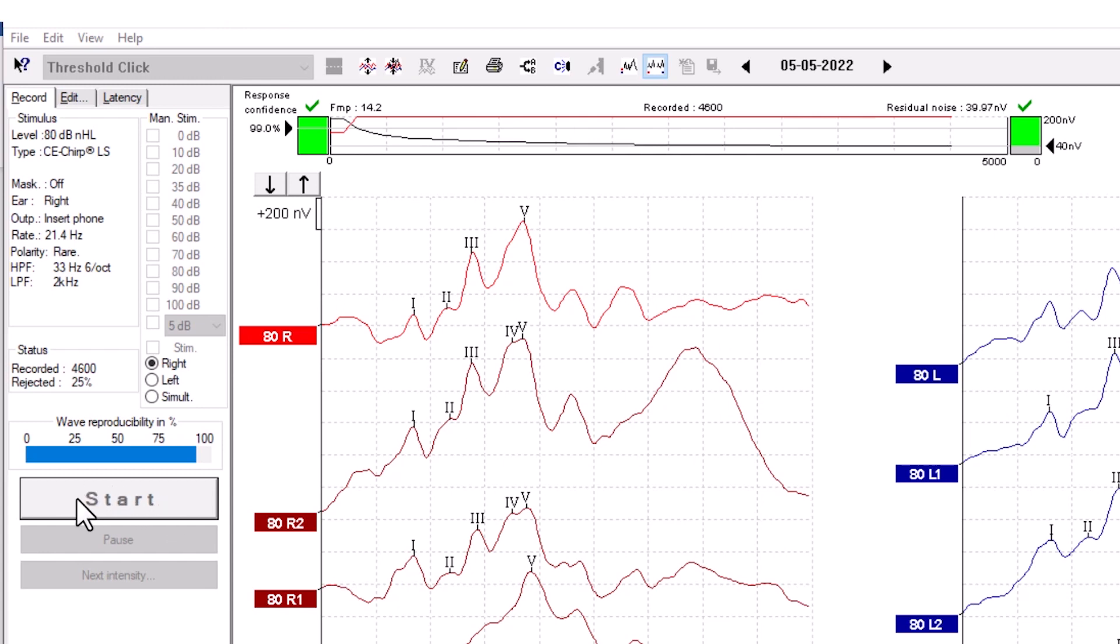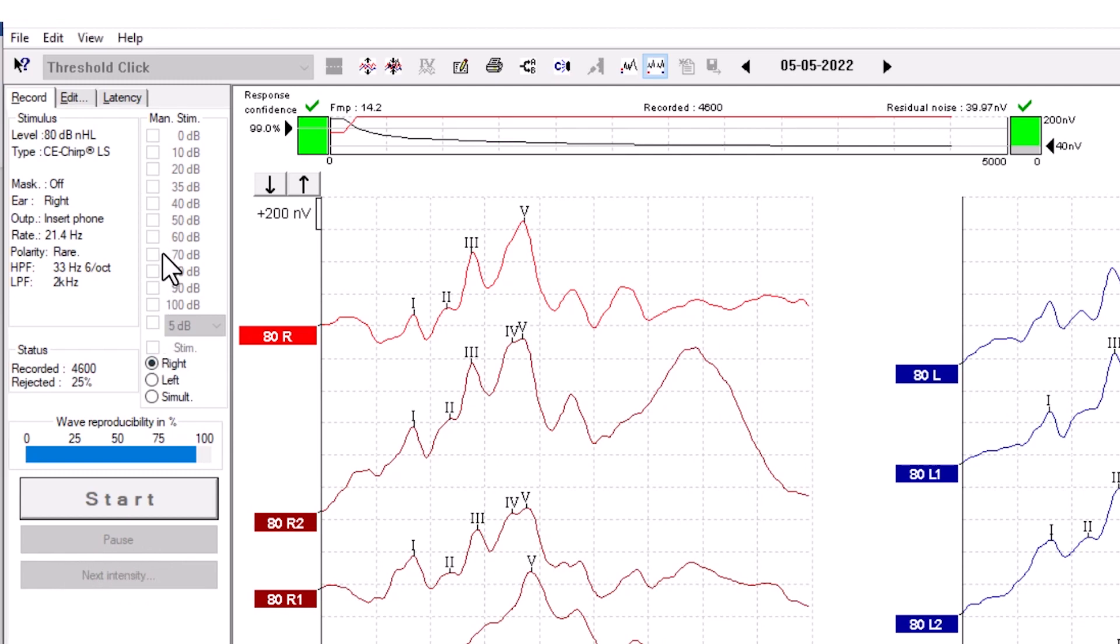Press Start to start your measurement. Press Pause to pause your measurement. The stimulus will still play. Press Next Intensity to change to the next intensity that you have selected.